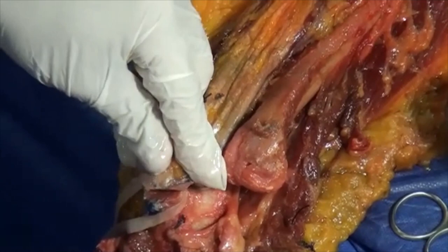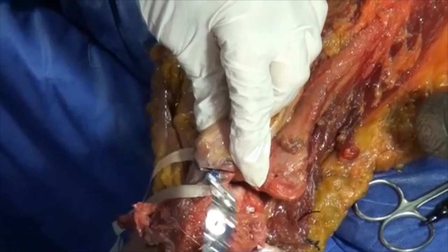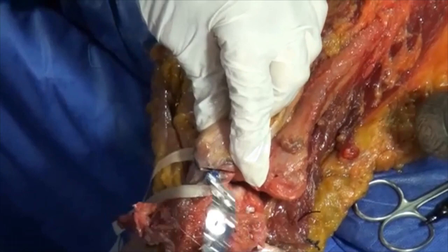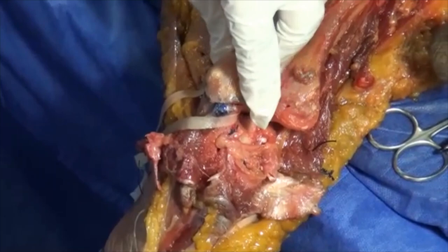For fixation of the olecranon osteotomy, you can either use a K-wire tension band or a plate. There is a plate on your table — you can place it and see how it fits on the olecranon. Note there are right and left versions, so it depends on whether your cadaver is right or left.